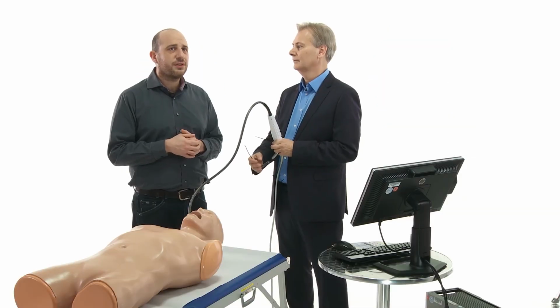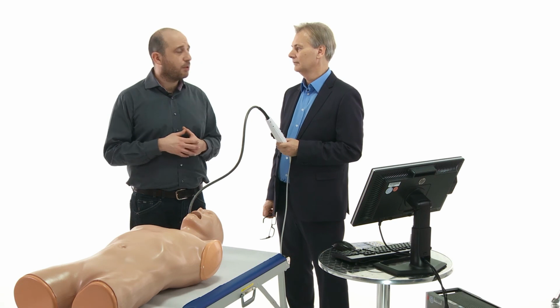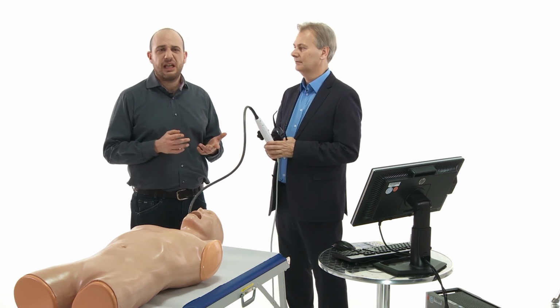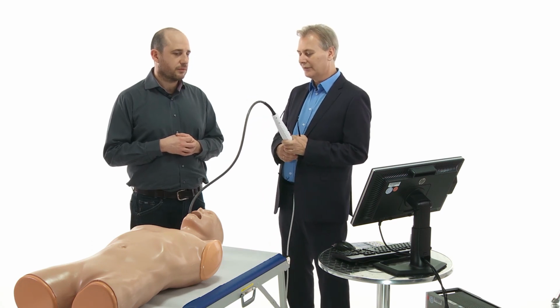We saw that after 7 or 8 hours, a lot of patients had some small lesions of the pharynx and of the esophagus; very seldom does it happen in the gastric position. But anything serious to worry about? No. There were only erosions and small hematomas, 2-3 millimeters, not very big. So nothing to really be concerned about. And so when you have the probe inside, then you're ready to go.